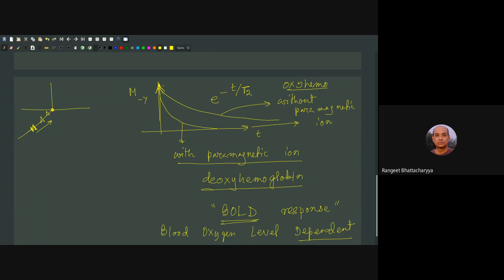Usually, suppose there is a proton distribution, we call it rho, then what you look at is more like 1 minus rho. So you will notice that the portions where you do not expect any signal show up as brighter. But does that matter? Does it matter that we are looking at the wrong thing?